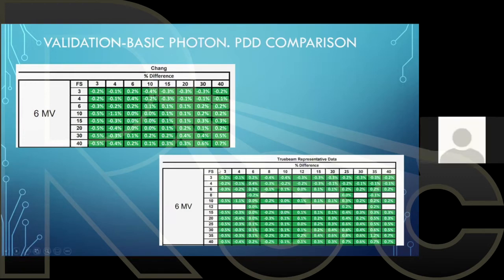Paulina? Uh-huh. Just a comment, because I don't know the exact name of the TG, whatever, the AAPM report. They're not recommending to use the golden beam data. Oh, yeah, TG, they don't recommend it. But there are some places, and I have colleagues, that have used it. This is based on personal experience and preferences.